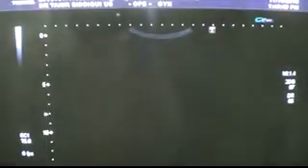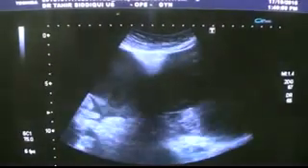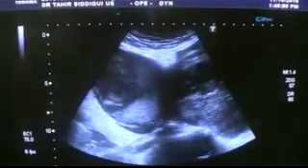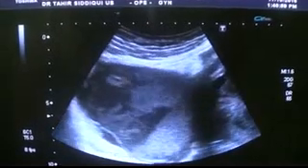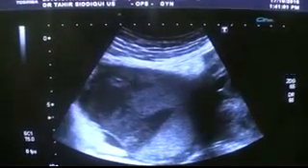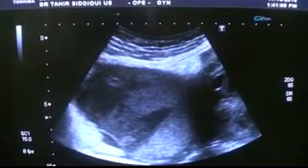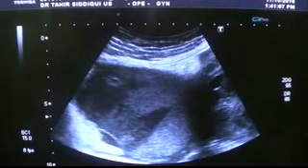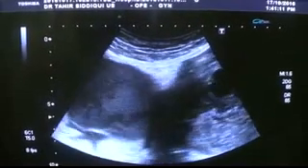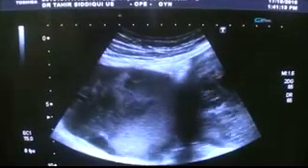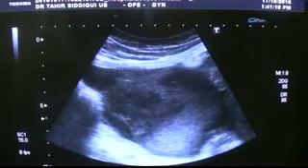Now I am going to move the probe towards the right hypochondrium from the region of the right adnexa. This is the right adnexa and this is a fluid-filled pocket — full of echoes — and you can see a small amount of fluid posterior to it. It is an extension of the same; it is not separate from the complex mass.